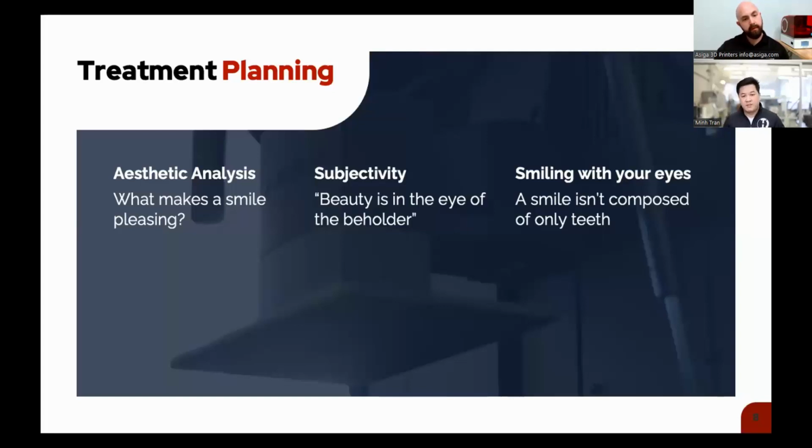Maybe they send us the patient to chat for a shade consult or something like that, or they just send a model. But really, for the aesthetic analysis, we need to break down what makes a smile an aesthetic one, right? And as the quote here says in the middle that you can see there, beauty is in the eye of the beholder. And of course, beauty is very subjective.